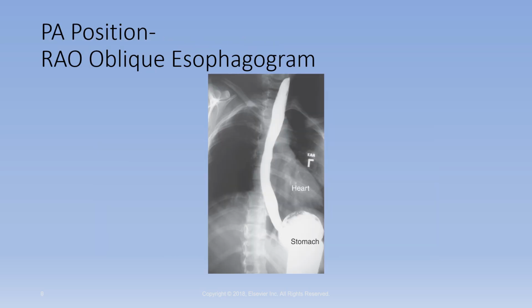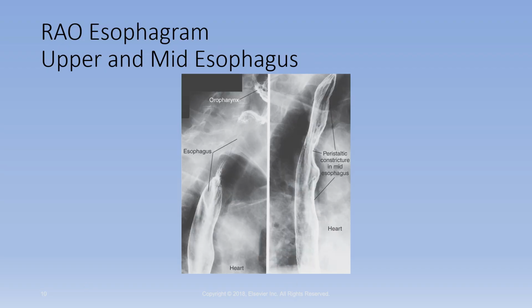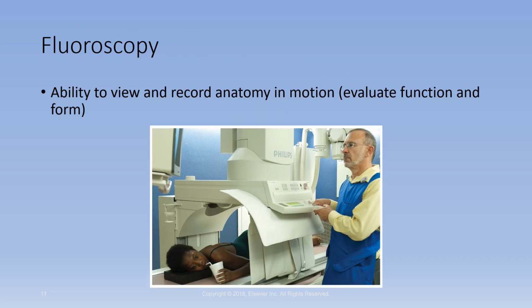This is a position of an esophagram showing you the entire esophagus full of barium passing into the stomach. And this same thing, different patient, showing you the mid and upper esophagus.